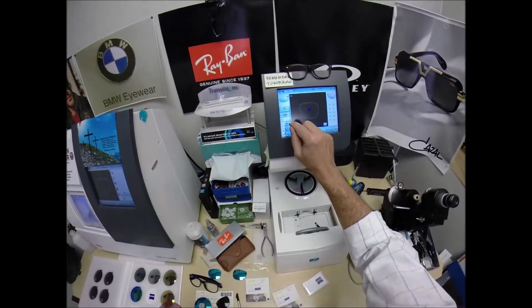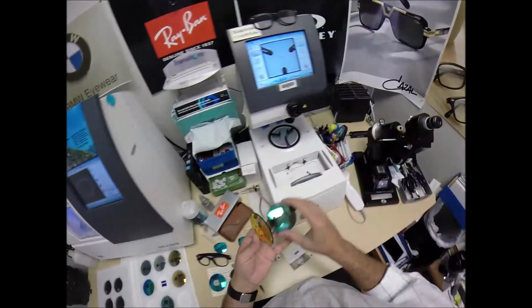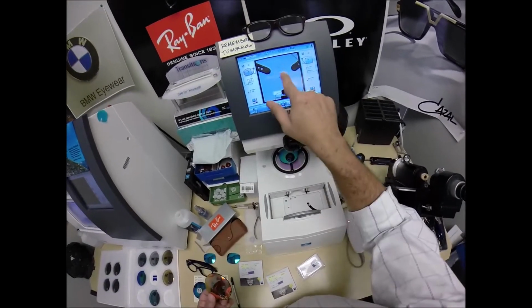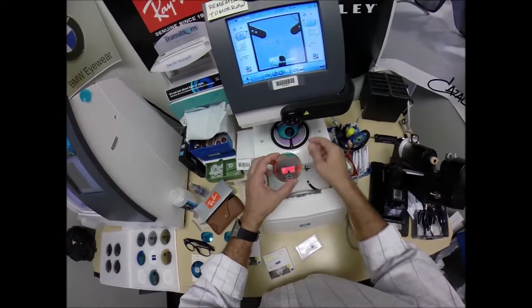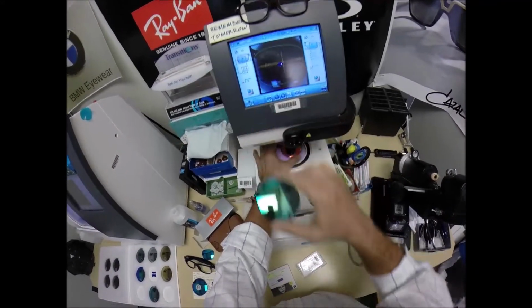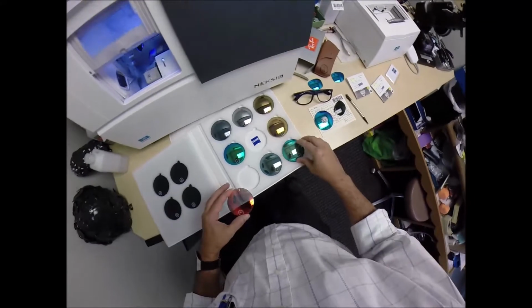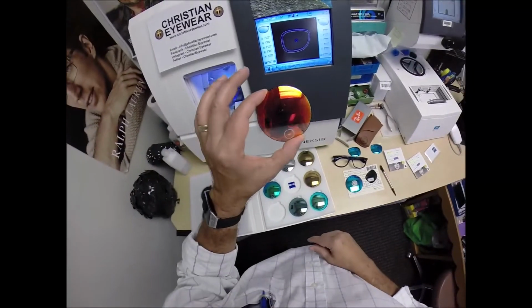You saw me over here doing this color. You can see through these to where that orange crosshair is. Pay attention when I put the red here. It goes pitch black and I can't see what I'm working on and the three dots on the lenses. So I can do videos for any of these colors, but not red.